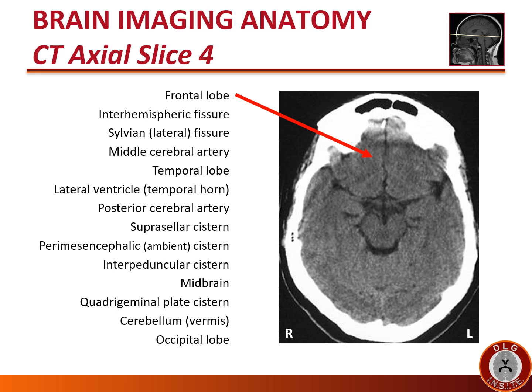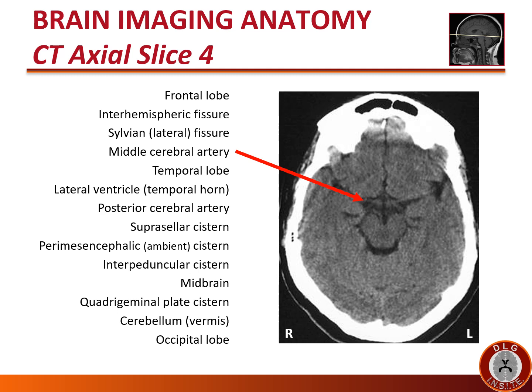Anteriorly at this level we see the frontal lobe. In between the frontal lobes we see the CSF space called the interhemispheric fissure. At this level, we continue to see the sylvian or lateral fissure, separating the frontal lobe from the temporal lobe — and again, where the middle cerebral artery runs. We do see the middle cerebral artery as an isodense tube running from the circle of Willis into the sylvian fissure.